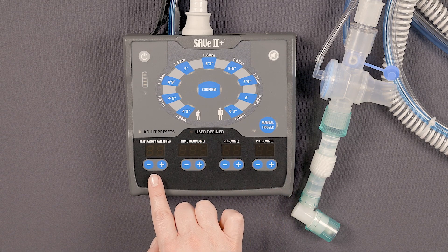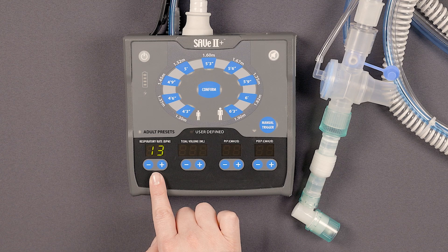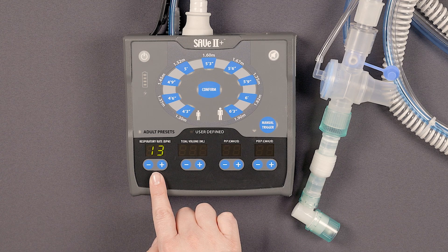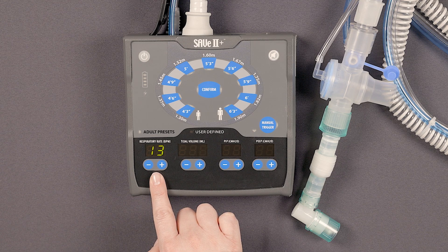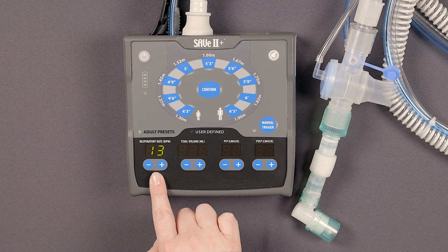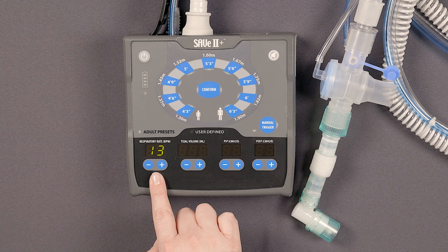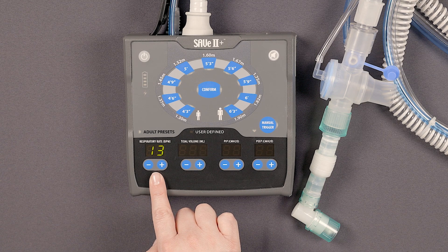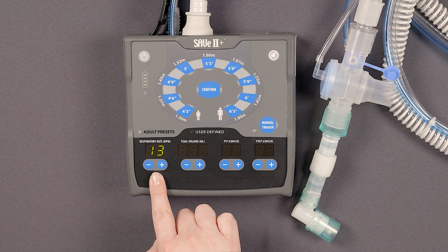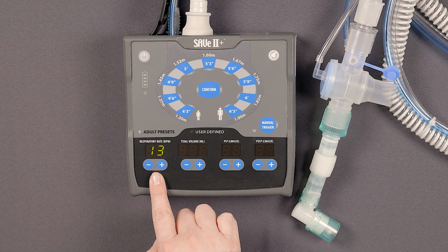These buttons are used to control and display the respiratory rate and monitor the number of breaths the ventilator is delivering each minute. This will be set automatically once the adult height preset is selected, but can be manually increased or decreased using the plus and minus buttons.